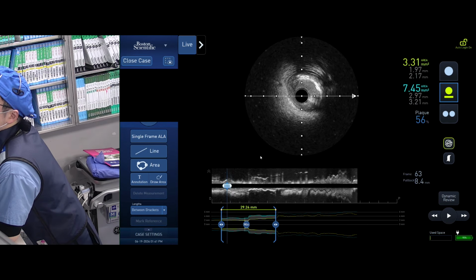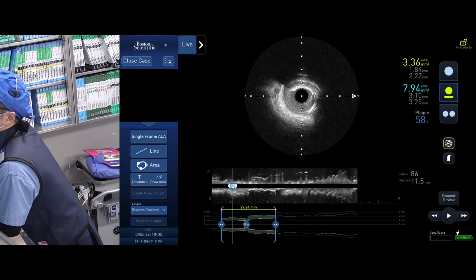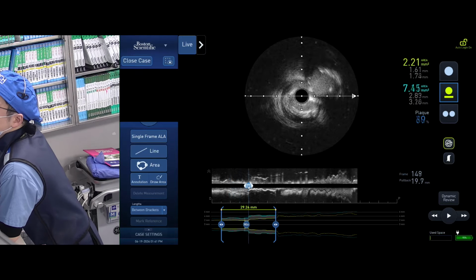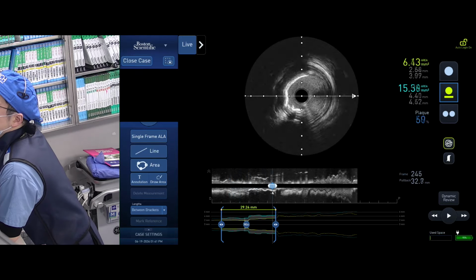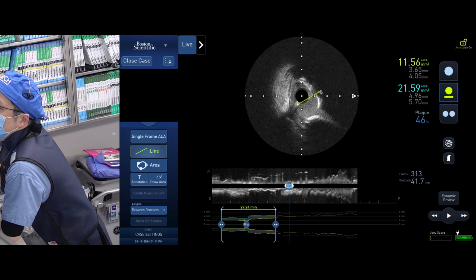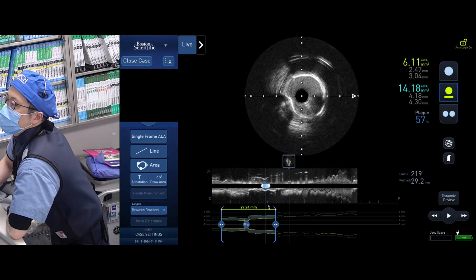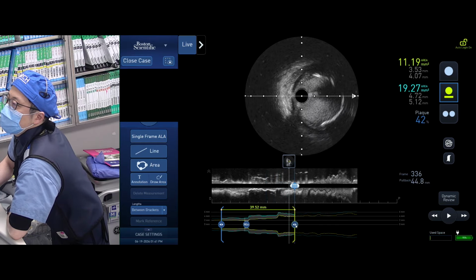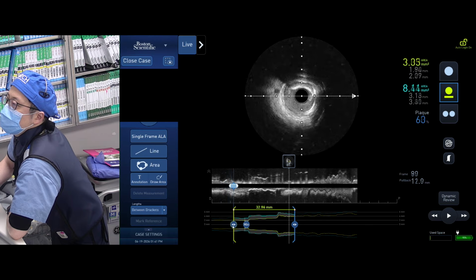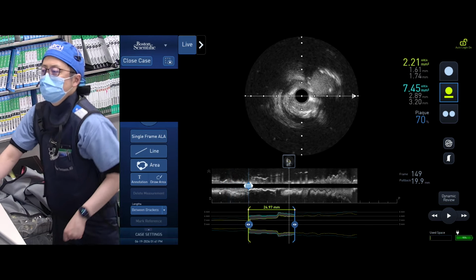Yeah, some slight injury. Any question from the panelists? I mean, everybody feels strongly about two stent here. I think provisional seems to be the way to go, but if anyone feels we should do two stents. No, I think the main issue, the diag looks great. I think the main issue is just getting the length of the LAD such that you don't find yourself accidentally having to overlap at that diag origin. Whatever you choose should go across it, and then if you needed to put a second shorter stent more proximal, that's fine.